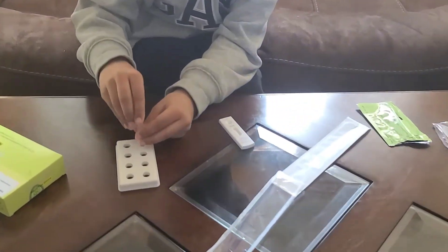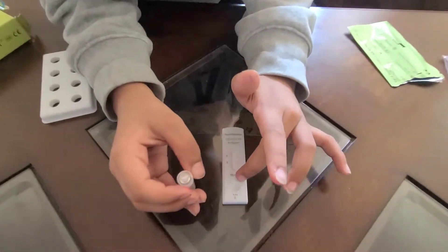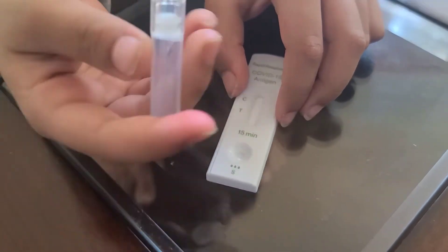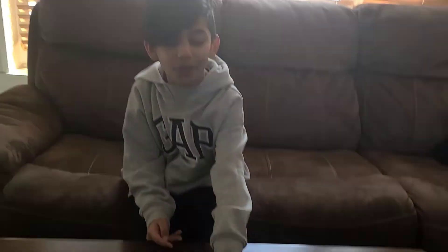I need to put this in it. There you go. What I'm going to do — you need to put three drops of liquid in it. One, two, three. There you go. I'm so scared, guys. I have to flip it over. I don't know if it's positive or negative.